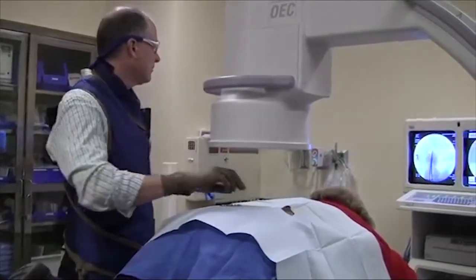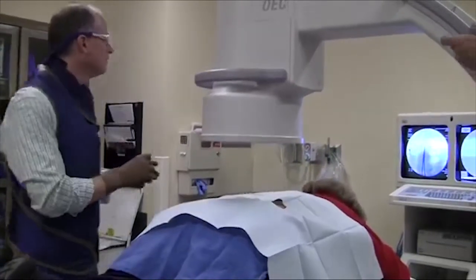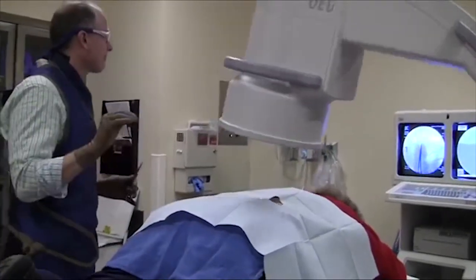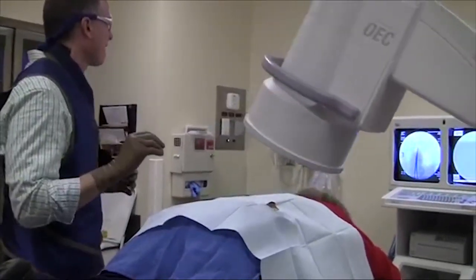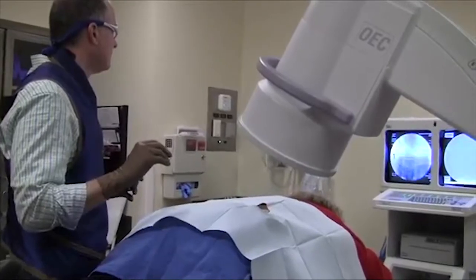Using a pointer, the location for the injection is identified using x-ray guidance.